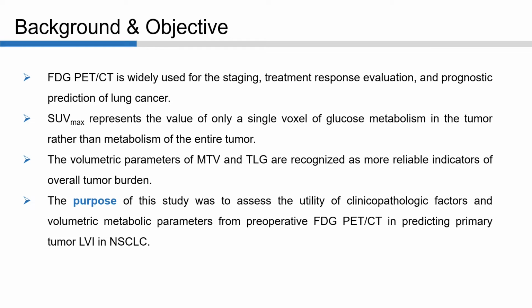Therefore, the purpose of this study was to assess the utility of clinicopathologic factors and volumetric metabolic parameters from preoperative FDG PET CT in predicting primary tumor LVI in NSCLC.